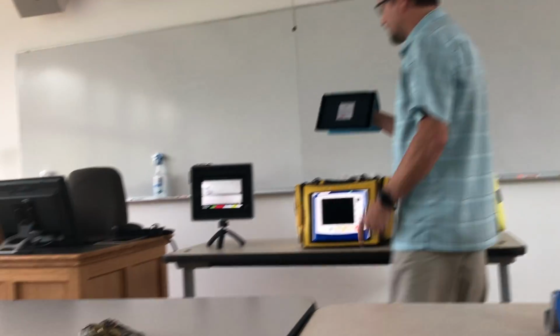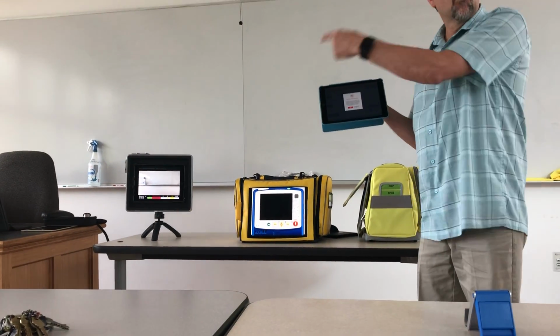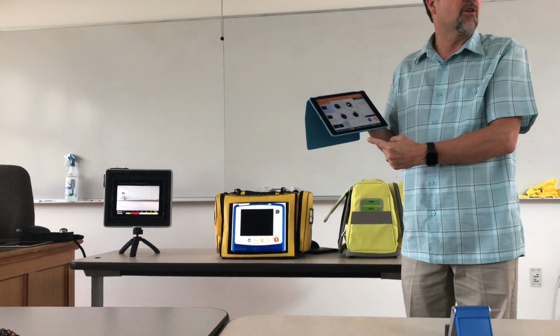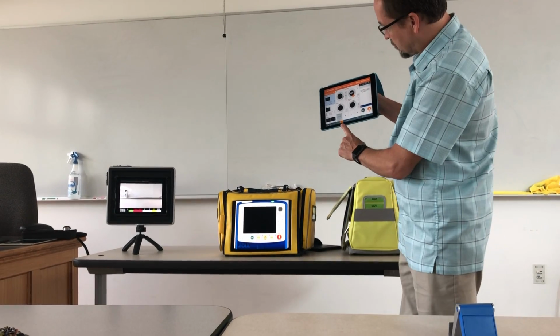And as soon as I connect, it pops up on your control, says, do you want to record this scenario? It won't record unless you say yes, you want to. And if you say yes, it's now ready to record, and it's going to start recording as soon as I hit the start button. Everybody with me so far? Start button. And start button's right down here.